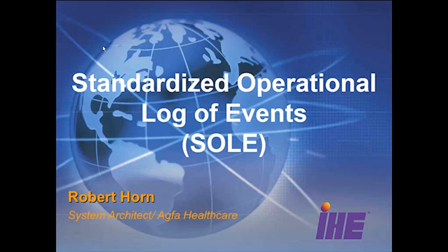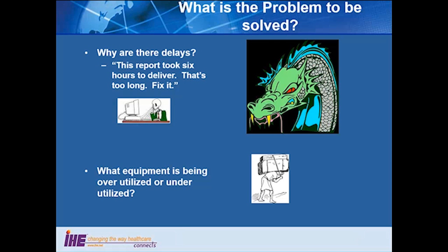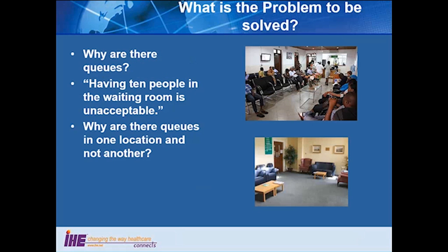So SOL is standardizing a log of events to solve some real business analytics, workflow management, hospital management issues. We start with the very basic. Why is it taking too long for the report? Angry doctors, overloaded equipment, underloaded equipment, systems sitting idle. It's increasingly hard to figure out why.